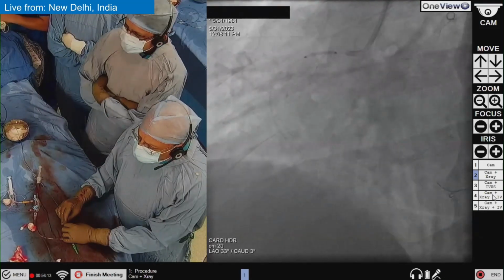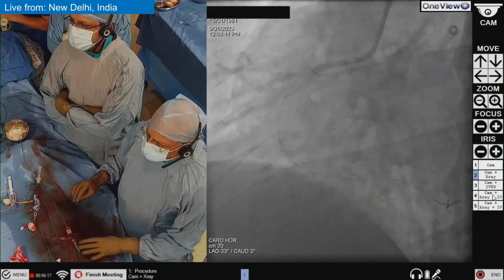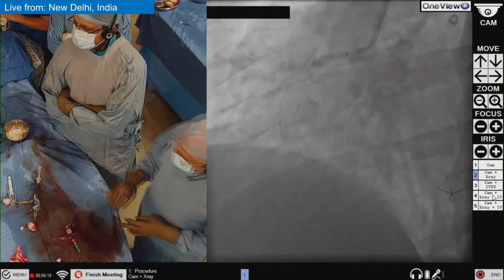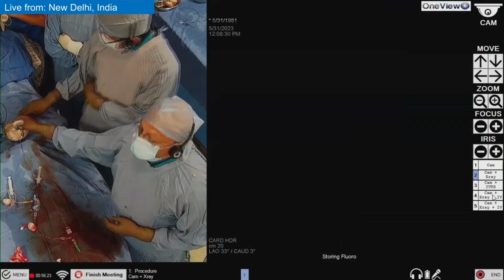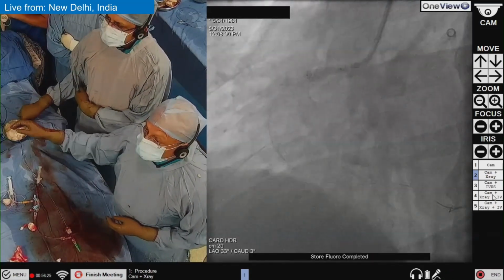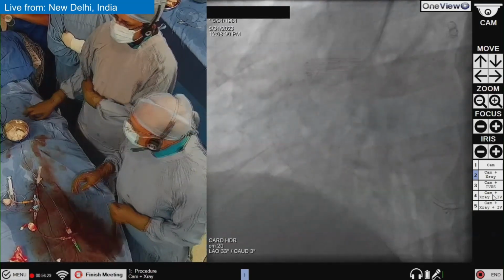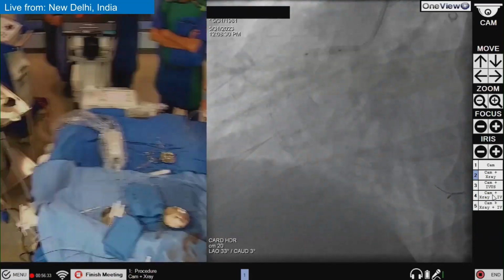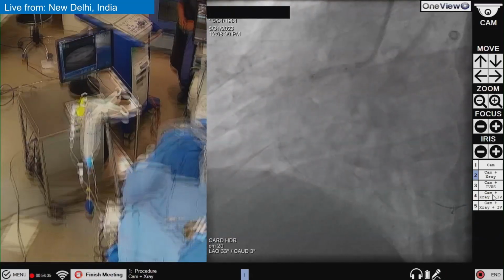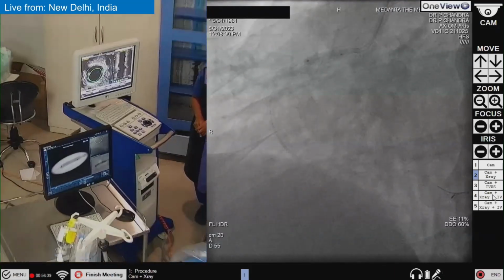1, 2, 3, 4, 5, 6, 7, 8, 9. Store it. 10, 12. Okay. So this looks again expanded well. 12, 14. Deflate. So this is fine.